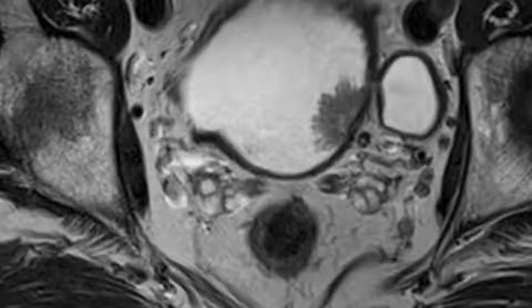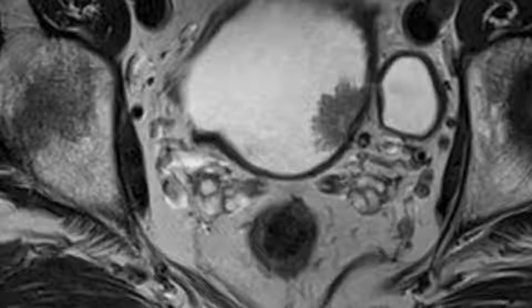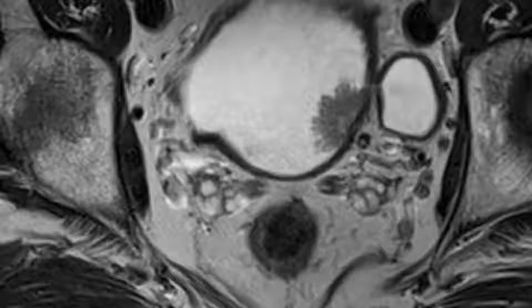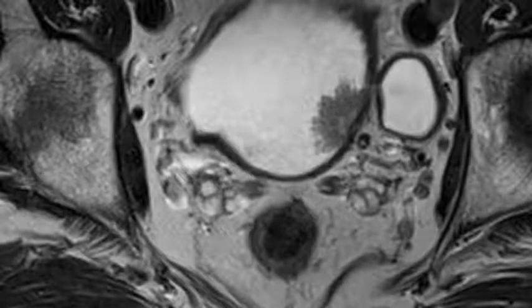Diffusion-weighted MR imaging. Diffusion-weighted MR imaging is increasingly being used for cancer assessment throughout the body and has shown great promise in the detection and characterization of other genitourinary malignancies. The role of diffusion-weighted imaging in bladder cancer is evolving and has not yet been fully established.